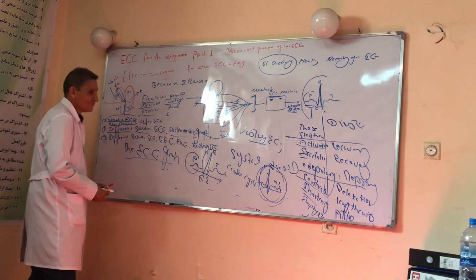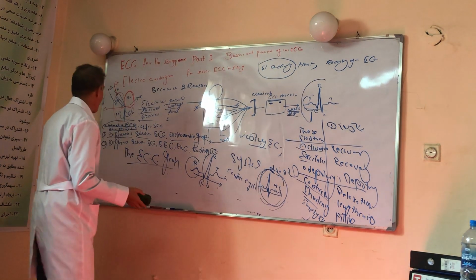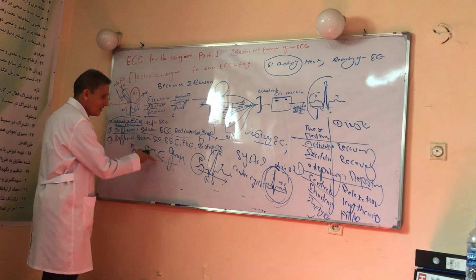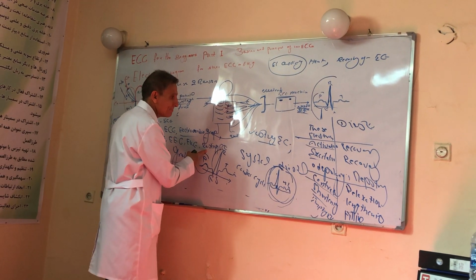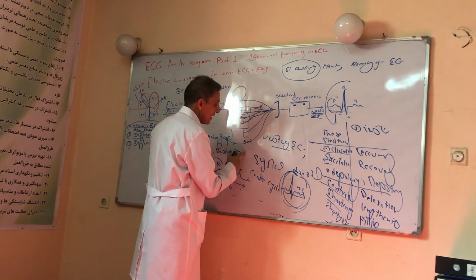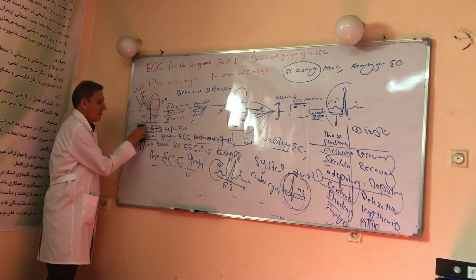Now the differences between again ECG, EEG, EKG, resting ECG, resting ETT, and ambulatory ECG recording. We will discuss these matters.